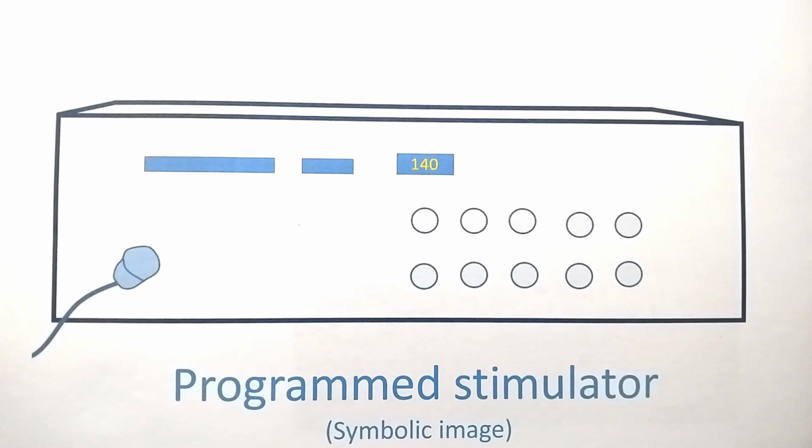This can check whether the abnormal rhythm can be produced in the electrophysiology laboratory and whether it corresponds exactly to what occurs spontaneously. And then you know the focus of origin, which can be ablated by radio frequency catheter ablation.